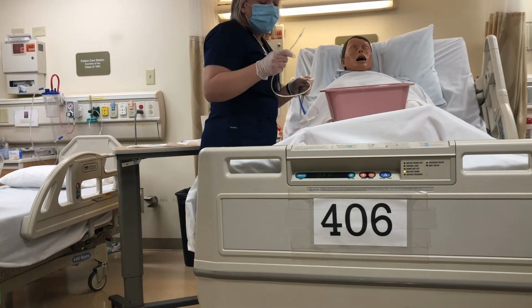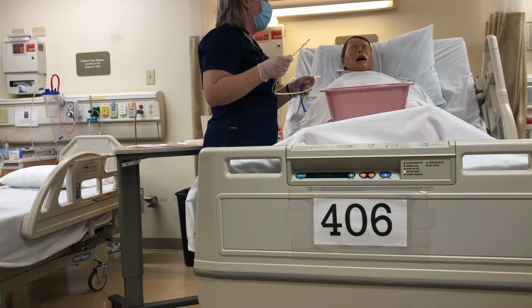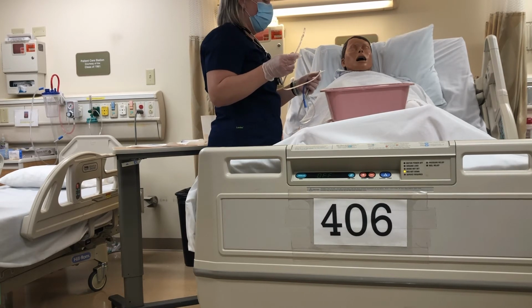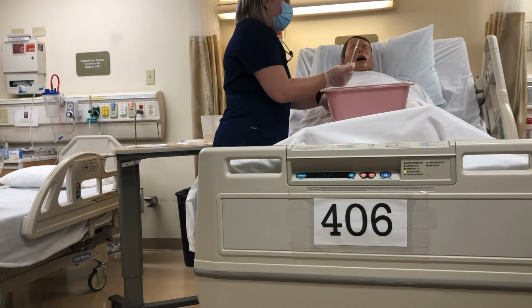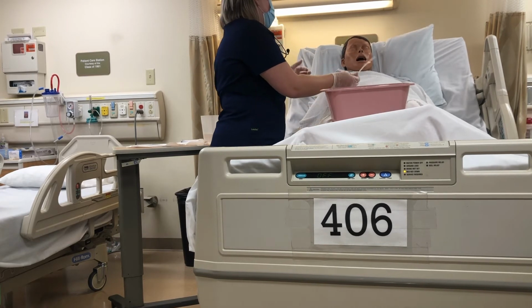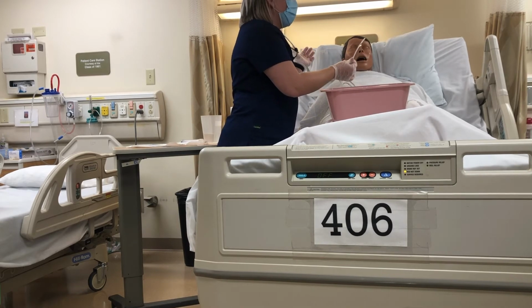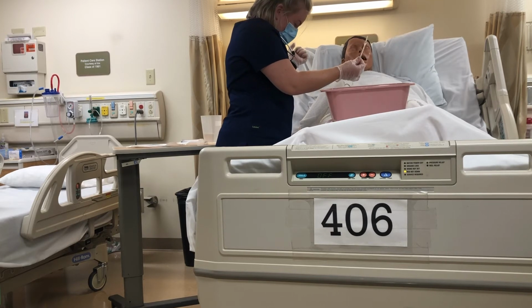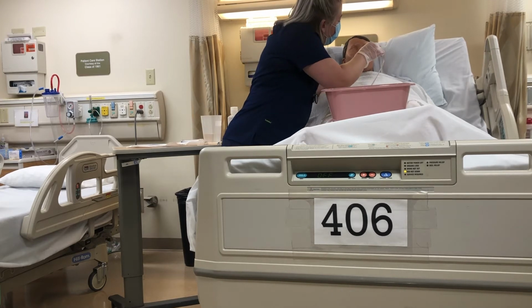Alrighty. I'm going to keep monitoring your oxygen while I place this NG just to make sure that you're satting at appropriate levels. Your oxygen looks great right now, so we'll just aim to keep it there, okay? Alrighty, so I'm going to start placing this down your nose, and I'm going to put my hand behind your neck, and then after about a few centimeters of passing, I'm going to have you tuck your neck into your chin, okay? Alright, are you ready?